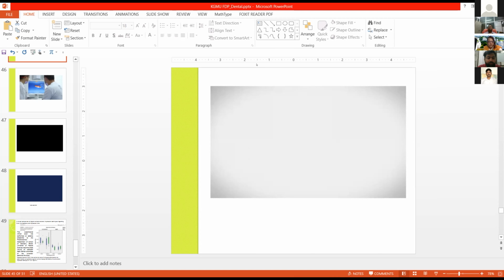Now the latest advancement, as we have seen in the video for the lab scanner by 3Shape, is the blue light. It is the advanced light, so that will differentiate it from the normal scanner, which uses white light. So that's a new advancement.